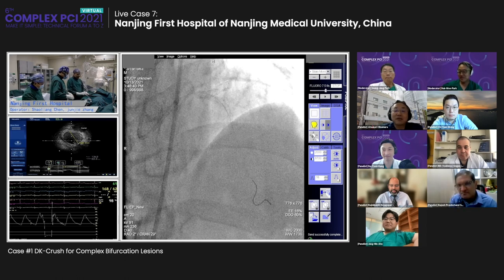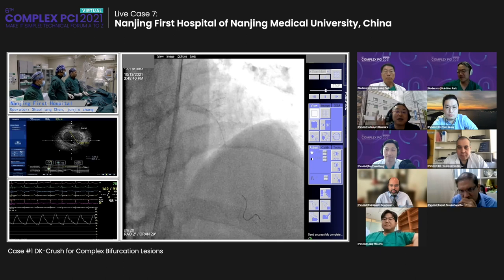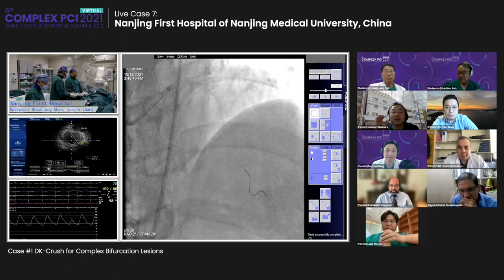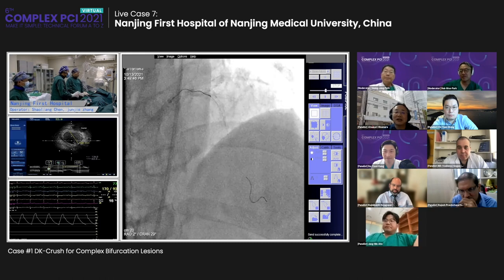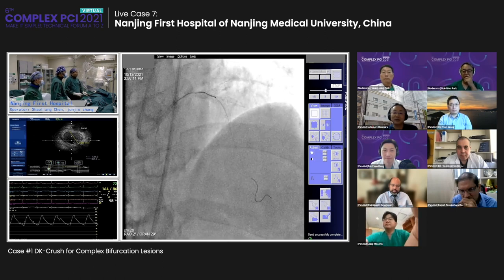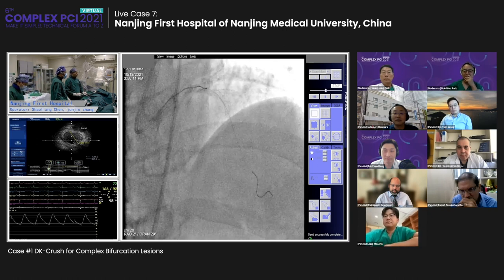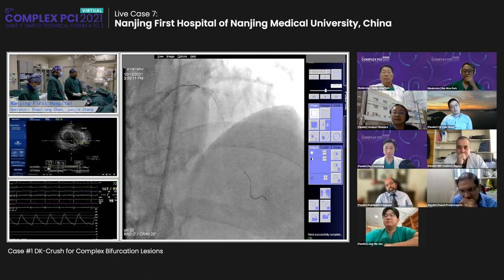I'm Atsunori Okamura from Japan. I'm a CTO operator. That's why in this kind of situation, I usually like to use IVUS, using IVUS-guided wiring with the tip detection method. The guide wire tip is correctly inserted into the exact point using the Gaia or Conquest. Do you sometimes use IVUS if it is difficult to pass the guide wire into the jailed point? Yeah, exactly. Intravascular imaging, IVUS or OCT, is used in more than 85% of PCI cases.